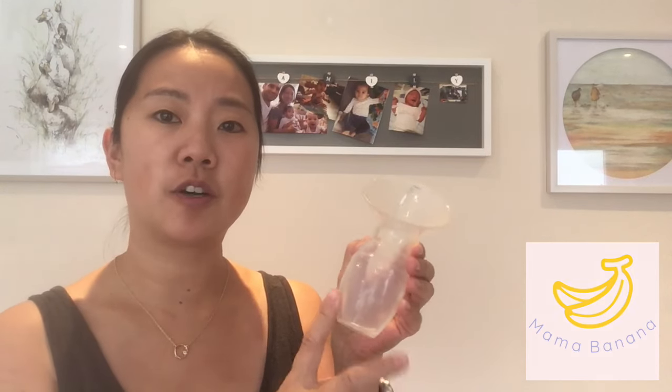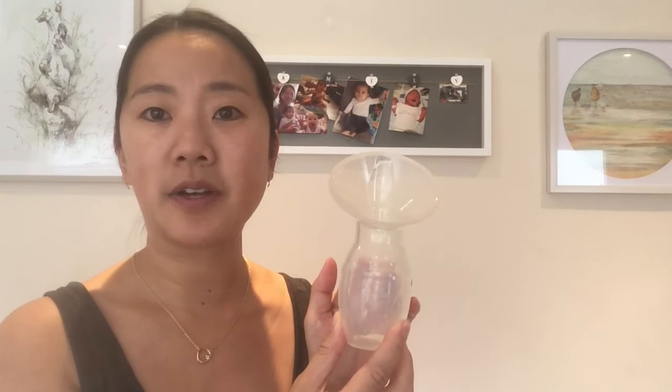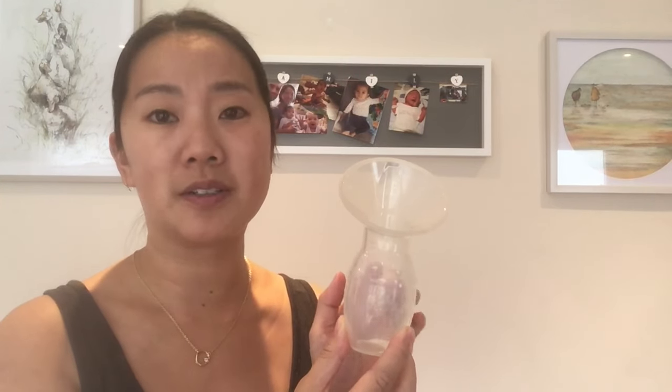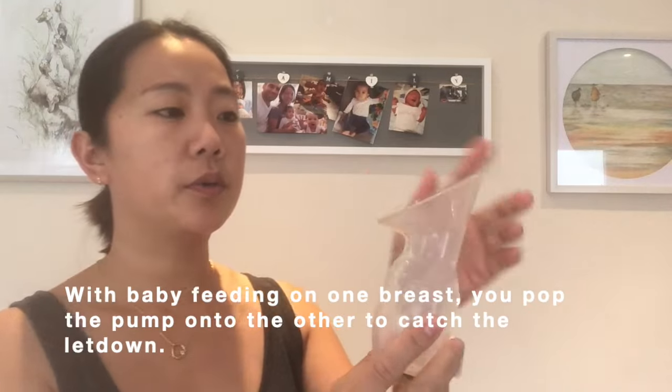I'm going to share how I use this to build up a small stash of freezer breast milk for my baby. I love using the Haakaa pump — I actually have four of these. They are great for catching letdown and helping you build up a small freezer stash. I actually almost exclusively used a Haakaa pump for my second child. It's a simple silicone pump that uses gentle suction to catch your letdown milk.